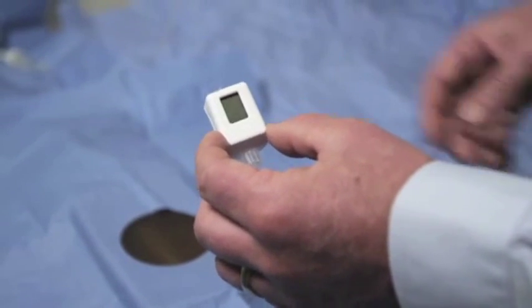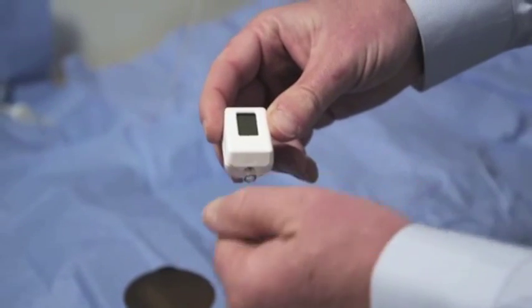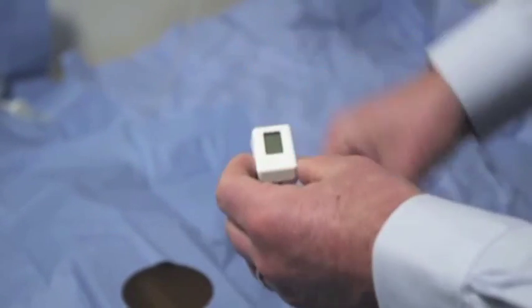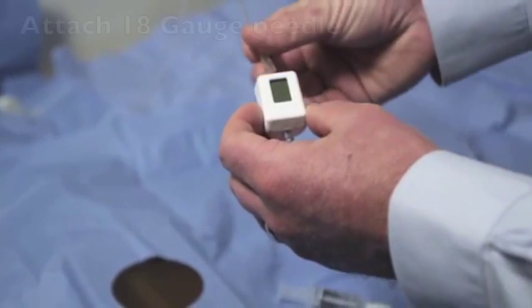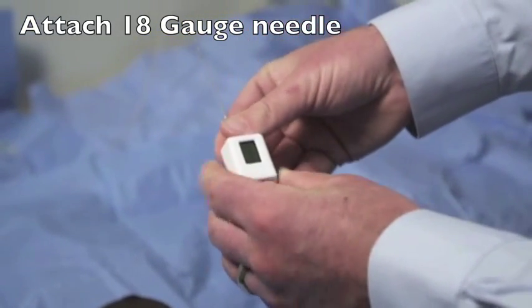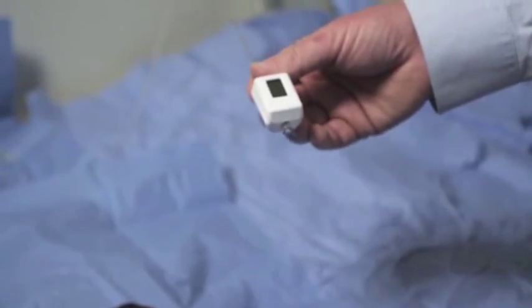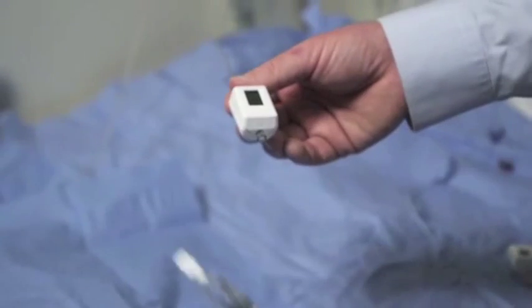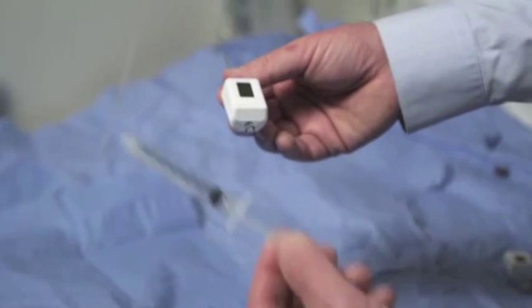Once the device is opened, remove the rear cap and attach the distal end to an 18 gauge needle. The proximal end can be attached to any syringe containing sterile saline.